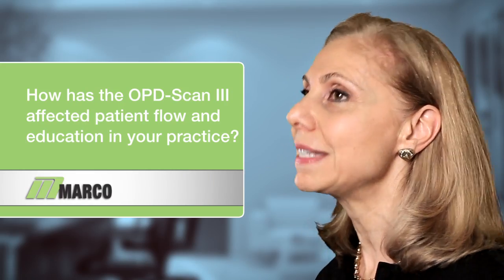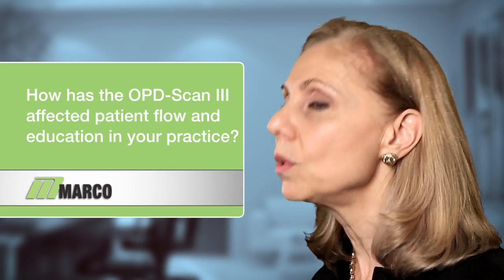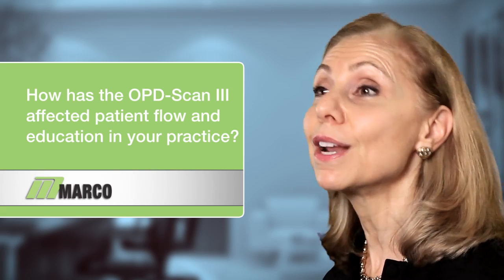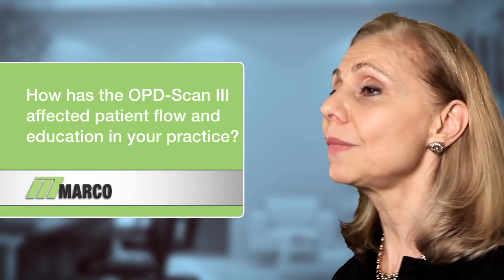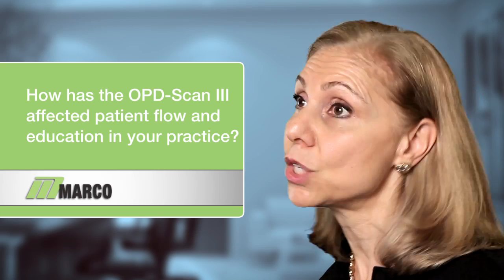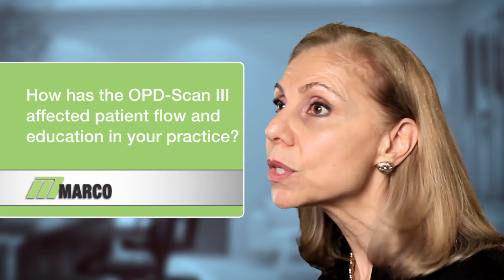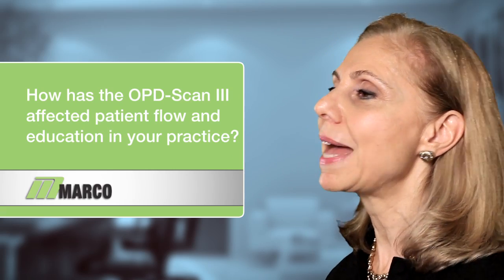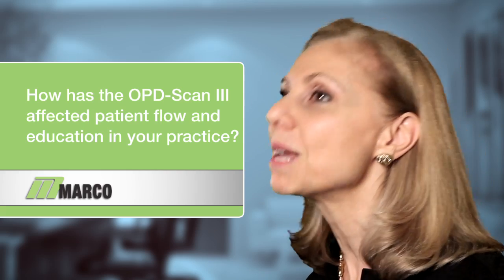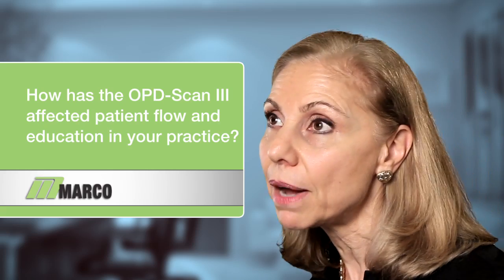Then this information is networked into our exam rooms. So when the patient is brought into the examination room, these maps are uploaded on a large screen monitor. So when I come into the room, the map is there, the patient is there, and his or her family member is there. So I am able to better explain what's going on. I am able to help the patient, quote unquote, see their astigmatism by pointing to the bow tie pattern that is displayed on the monitor.